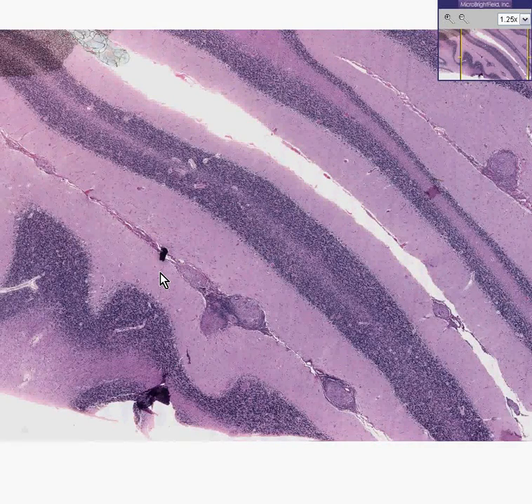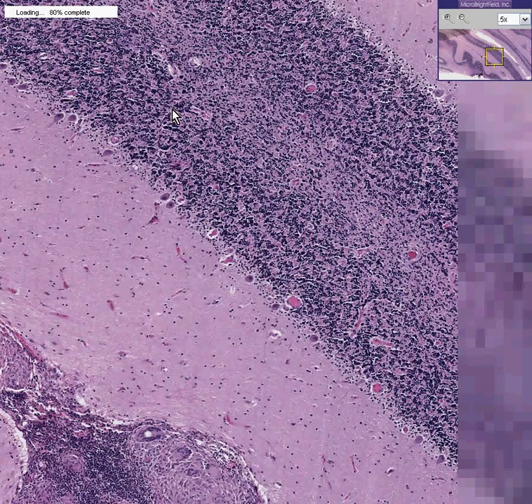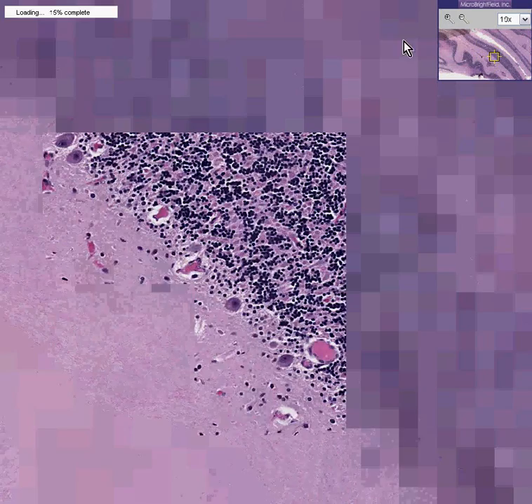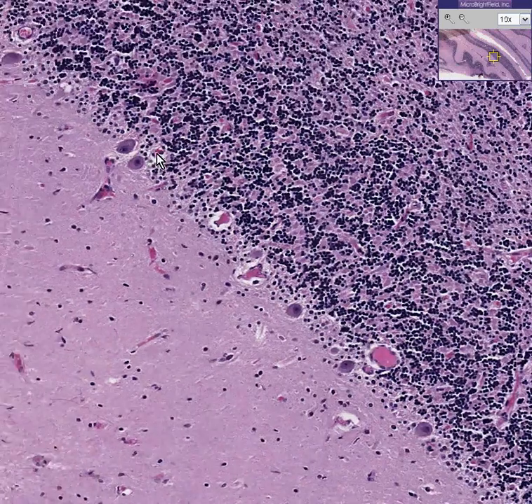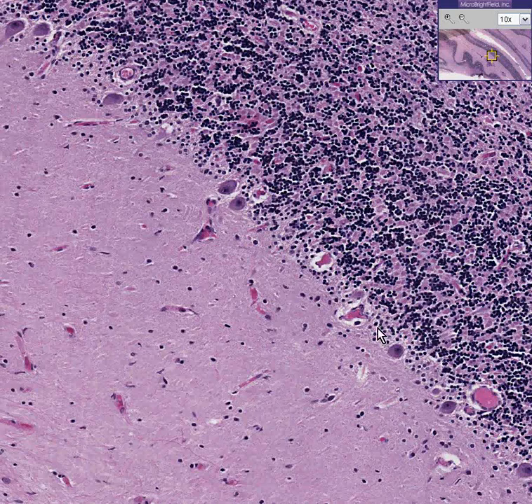Can you recognize this as being brain tissue, central nervous system tissue, and specifically cerebellum tissue? Of course you can, because you can see this nice layer of granular cells, the periphery of which are these huge Purkinje cells, so typical of cerebellum, and which makes them so recognizable instantly. Here are the Purkinje cells, 1, 2, 3, 4, 5, 6, 7, and here are the granular cells.